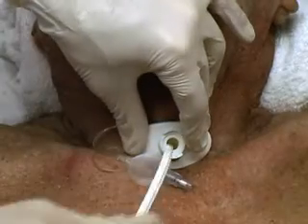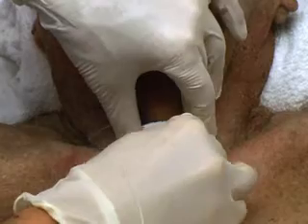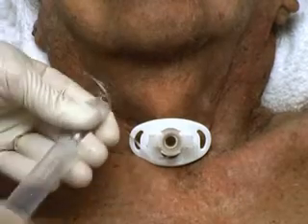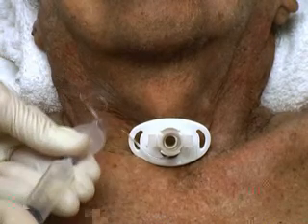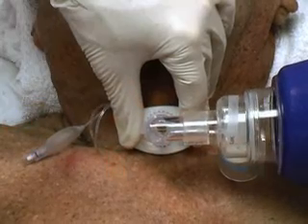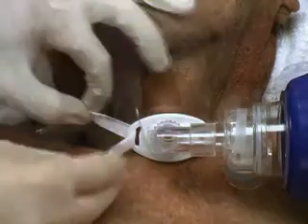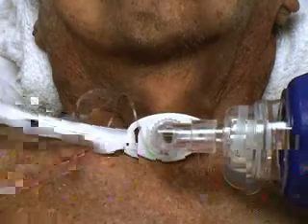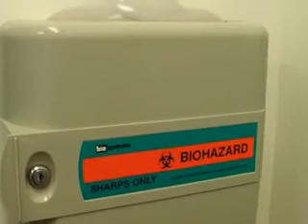Hold the cannula in place, remove the obturator, and attach the adapter. Inflate the cuff with a 10 cc syringe. Attach the valve unit and ventilate the patient. Look for symmetric chest rise and auscultate for symmetric breath sounds. Tie or suture the tube in place. Dispose of needles and sharps in the appropriate containers.